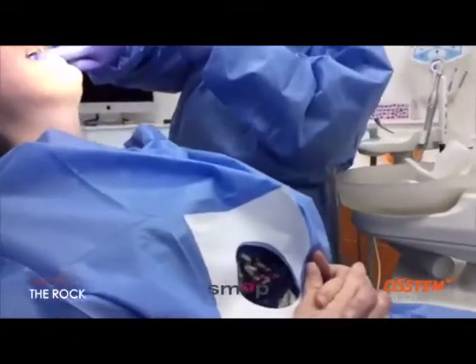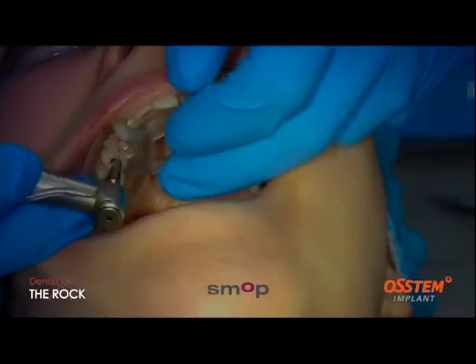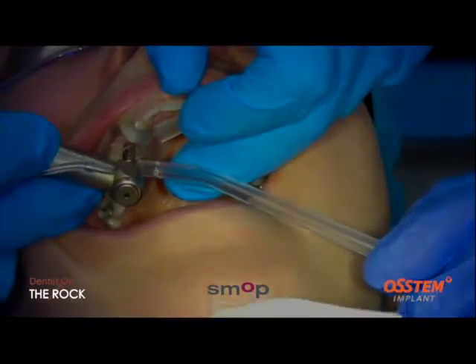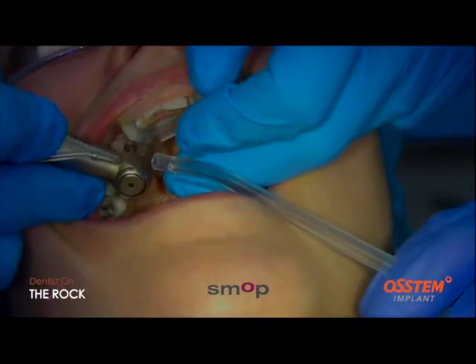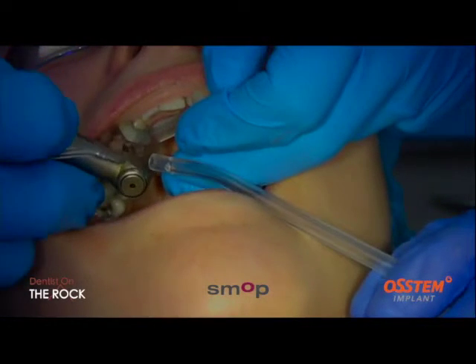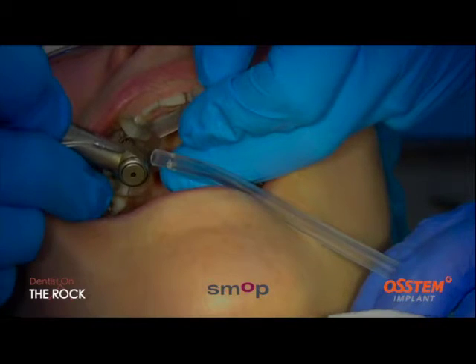That's better. There we go. So you see now where my finger rests and everything. Okay, so I'm supporting it. Tissue punch. Popping that through. And then you're going to feel a little bit of pressure now, Elizabeth. Okay. Remember what I said, if you need me to stop at any time, don't be afraid of asking. Okay. So pressure, pushing in.